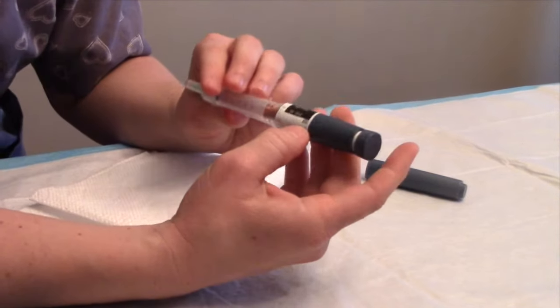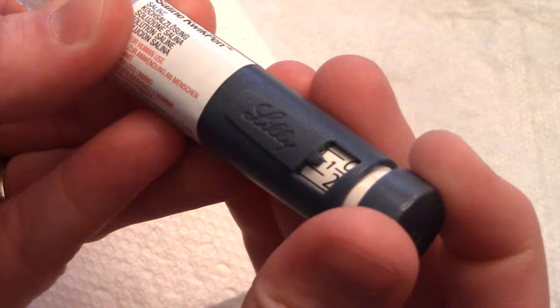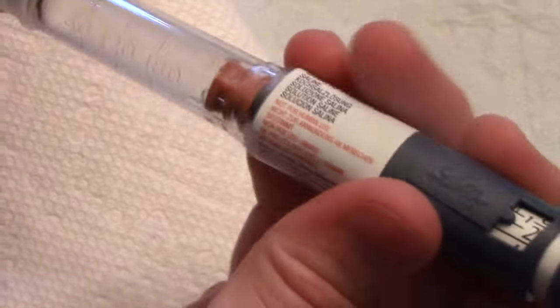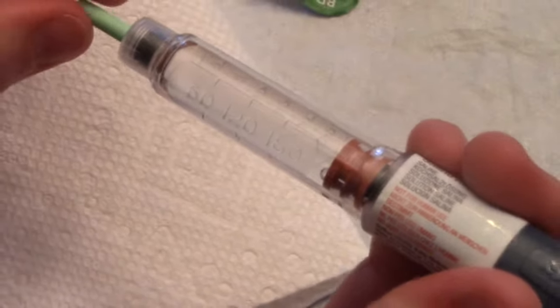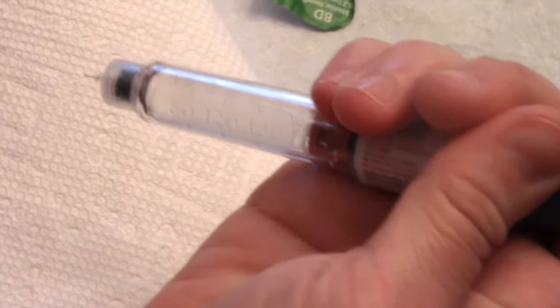The next thing to do is prime the needle with insulin. To prime it, you do two units, so I've dialed that to two. We'll take the cap off and also take this part off, which exposes the needle, and we'll make sure that it is adequately primed.